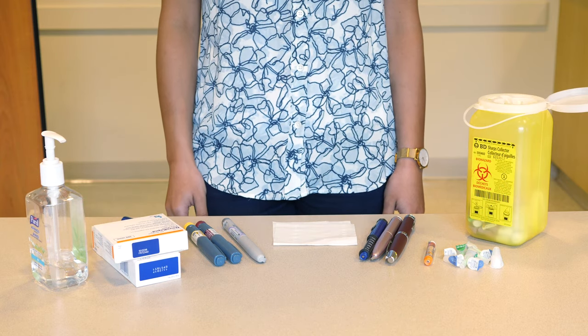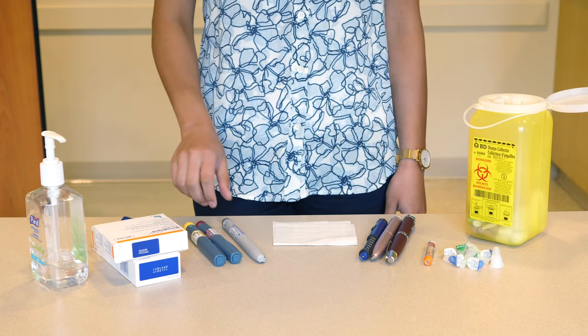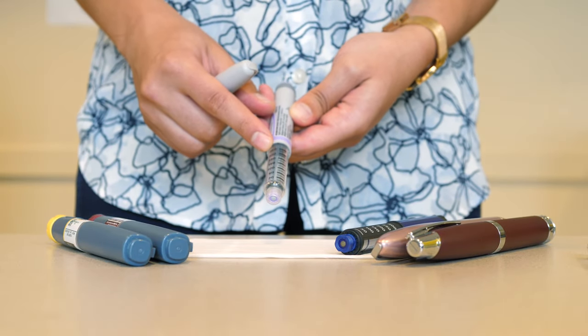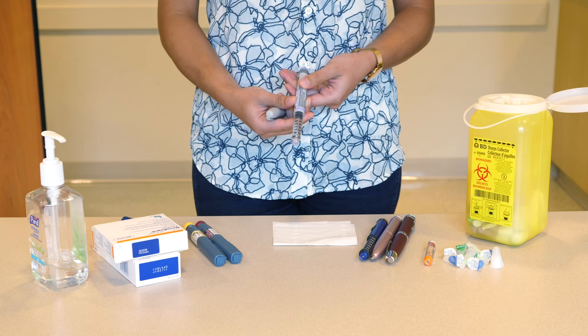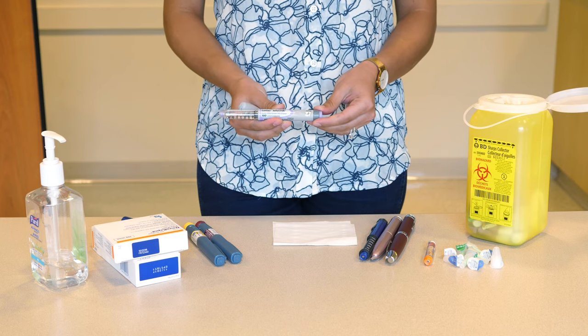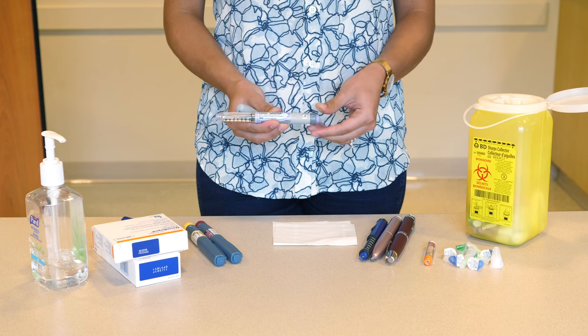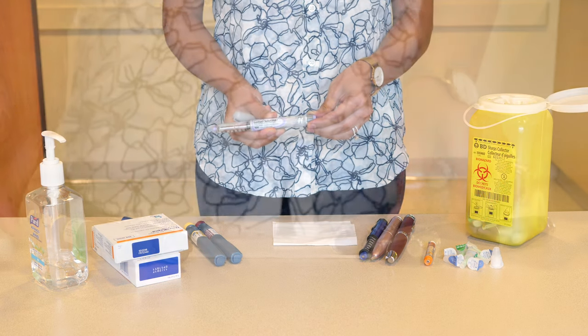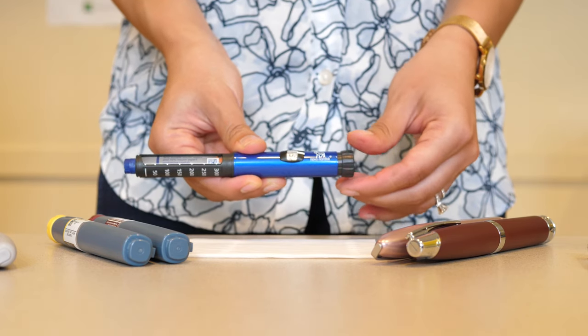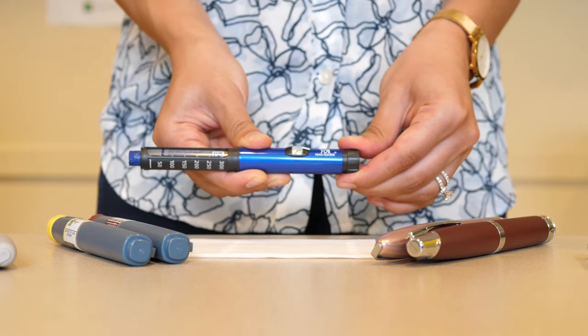All insulin pens or cartridges hold a minimum of 300 units of insulin, allowing for multiple doses. The pen dials up units of insulin. The way to dial up the dose is by twisting the knob at the end of the pen. For the Novo non-disposable pens, you need to pull out the end before dialing.